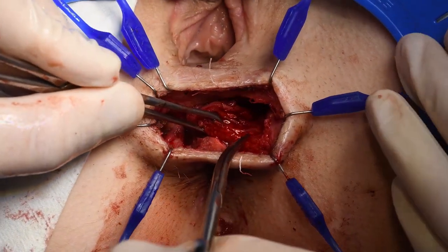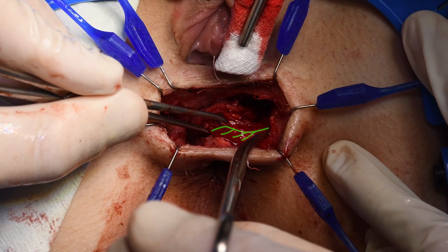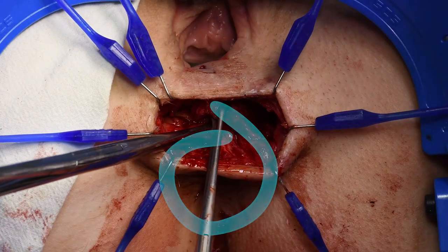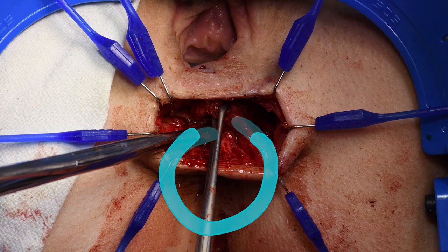Lateral dissection of the sphincter should be performed very carefully to prevent damage of the anal nerves, which are located at the 3 and 9 o'clock positions. Lateral mobilization is sufficient when it is possible to overlap the muscle edges by at least 2 cm.